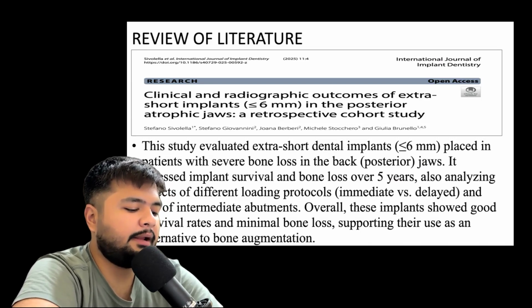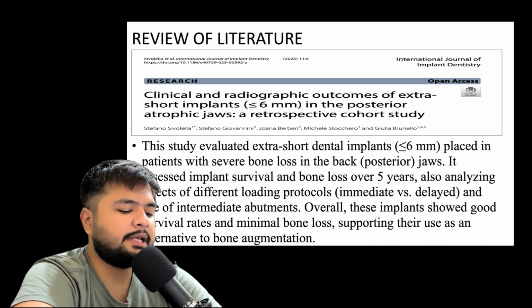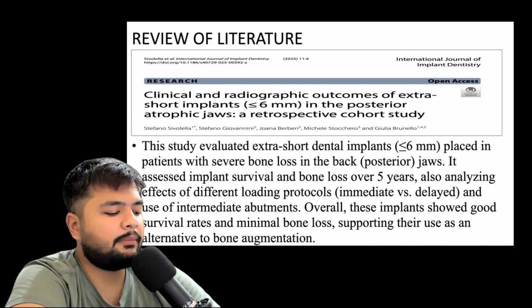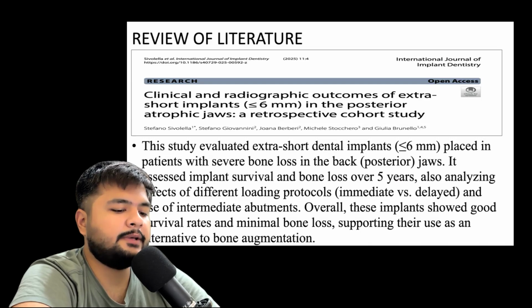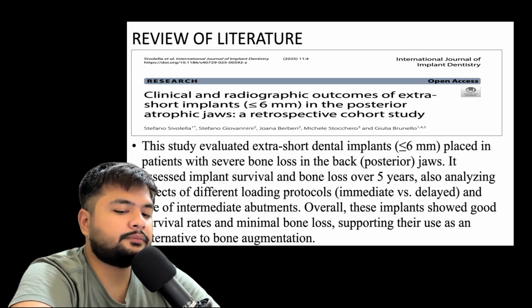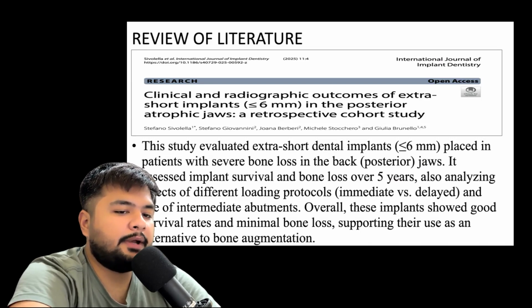Then coming to why intermediate abutments are associated with reduced marginal bone loss. The intermediate abutments create a vertical platform switching effect that may stabilize the supracrestal soft tissues and reduce the impact of micro movements and micro leakage at the implant abutment interface. Then immediate loading was done, with the provisional resin crown placed on the same day, and the width of the implant used was 5 to 6 mm, and all prosthetic components had a 4.1 mm diameter.